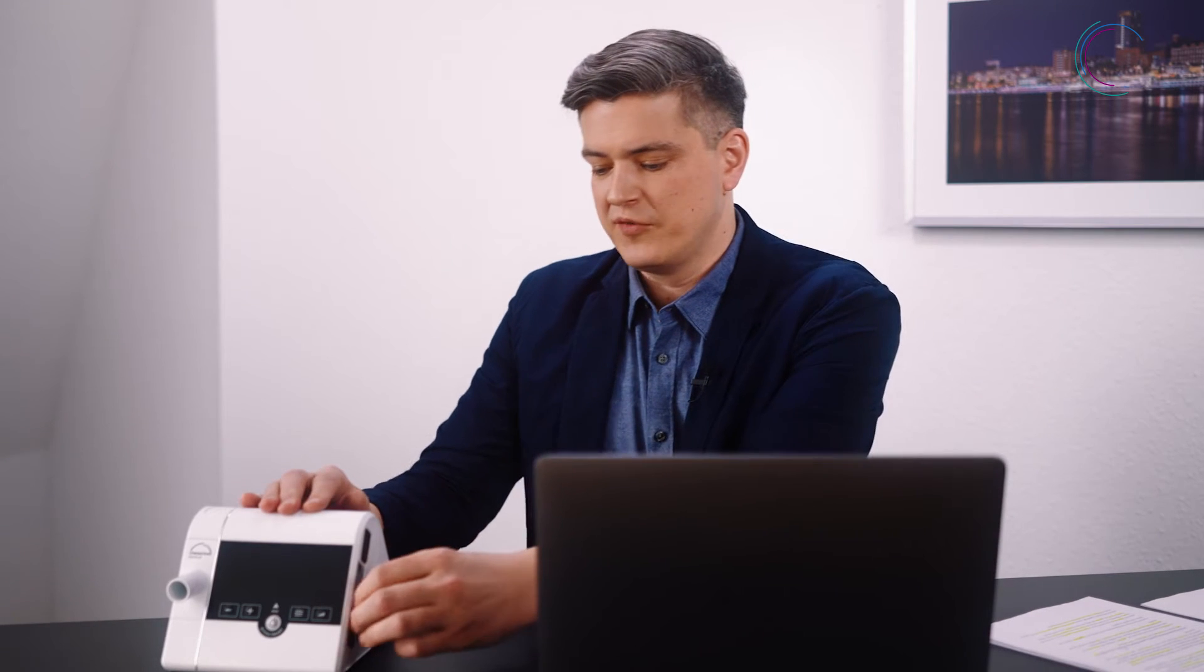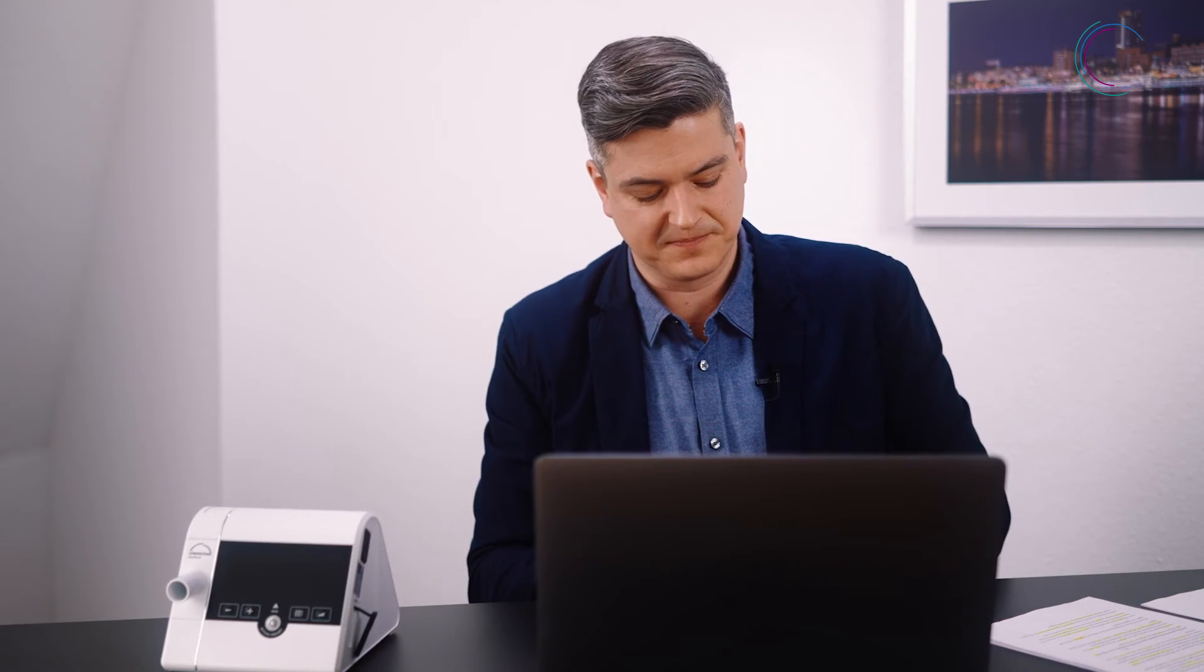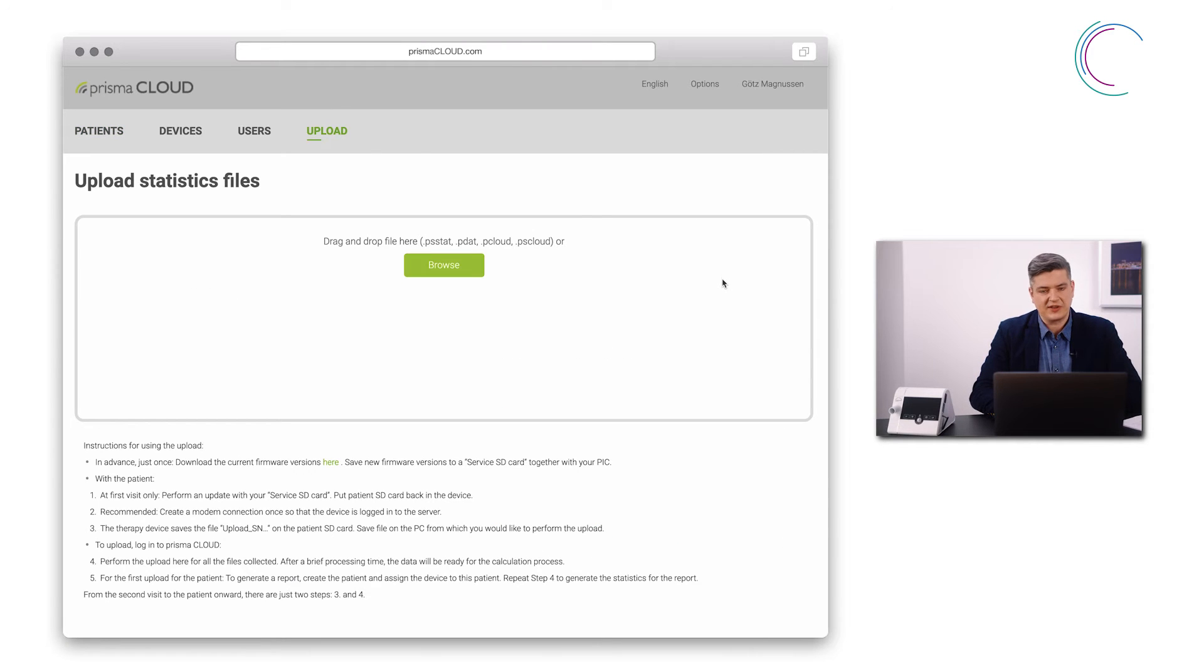To upload the data, simply remove the SD card from the device and put it into your computer. Log into Prisma Cloud and click on Upload. You will see this screen here.